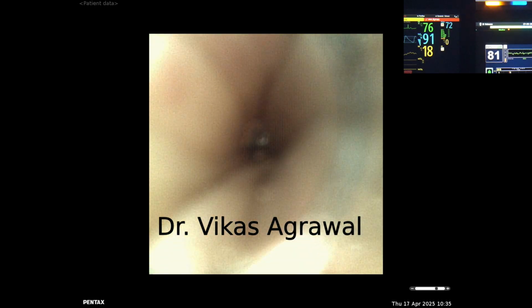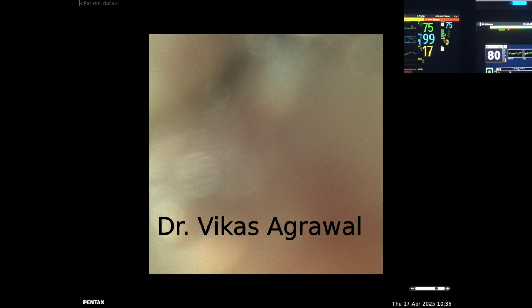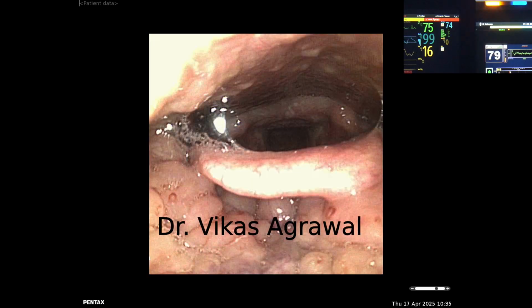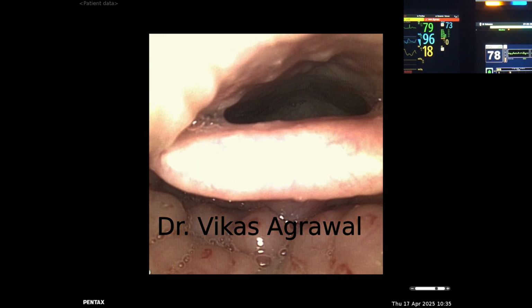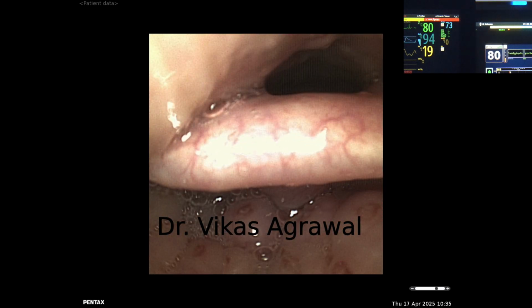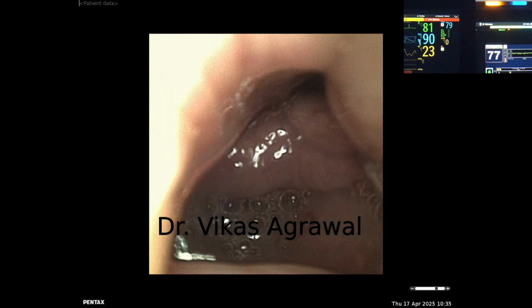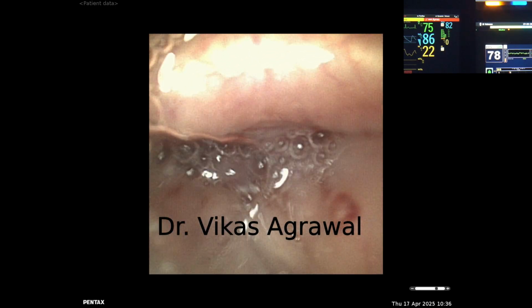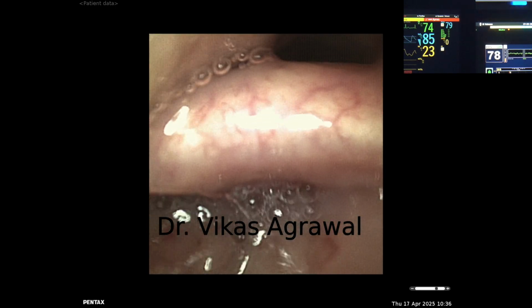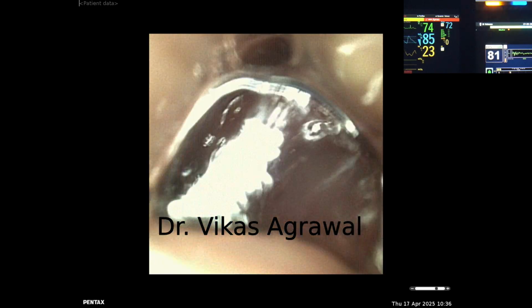And at this point of time, I'm trying to look at the base tongue and the epiglottis. So even the base tongue and the epiglottis is also collapsing. But this could be also, so this is certainly not Bernoulli's. You can see the base tongue is collapsing on the epiglottis. So this is secondary epiglottic collapse, not the primary epiglottis which you saw earlier.